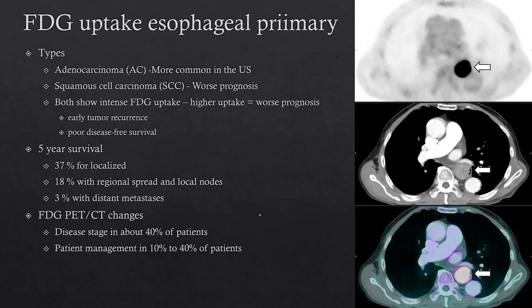FDG is good for staging disease in about 40% of patients and changes patient management in about 10% to 40% of patients depending on the study. In this example, you can see a mass on CT with intense FDG uptake, and on the fused images it matches the esophageal mass.